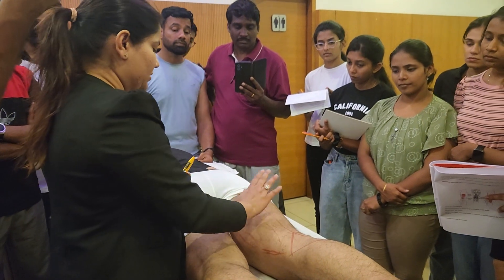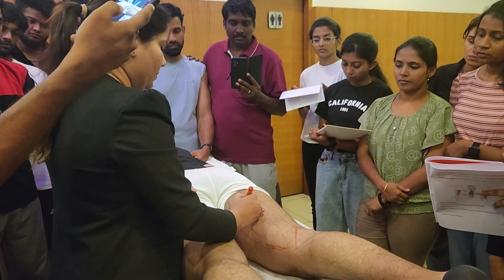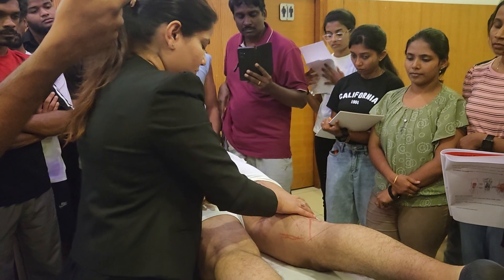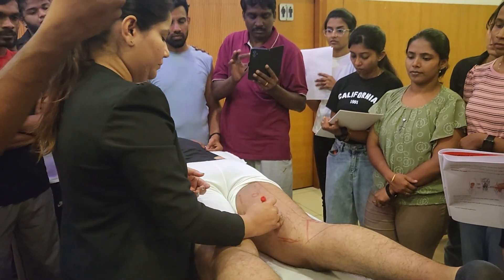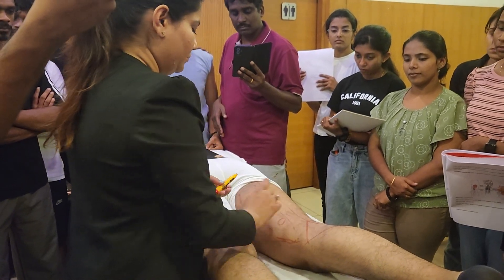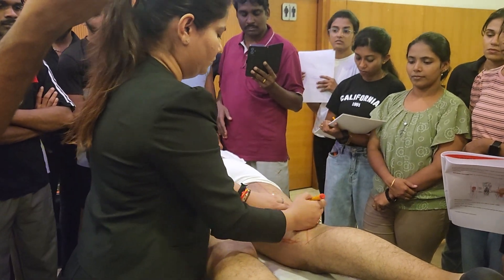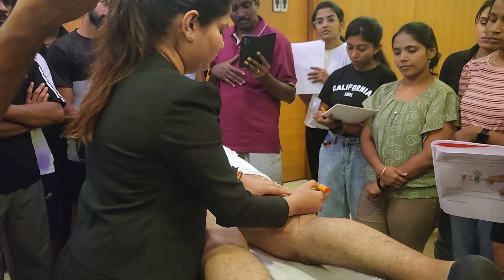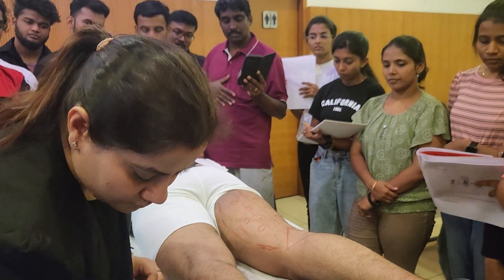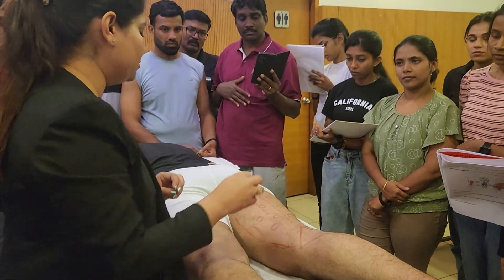Talking about the trigger points — 8 to 10 trigger points, all around you will get here, randomly placed. The needle size for this will be 40 to 75mm.